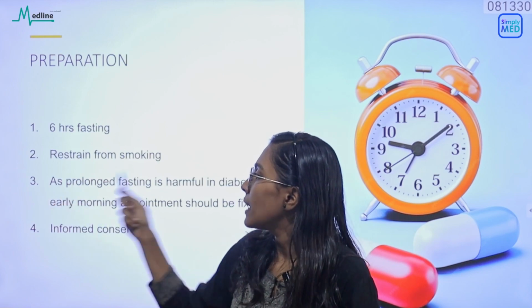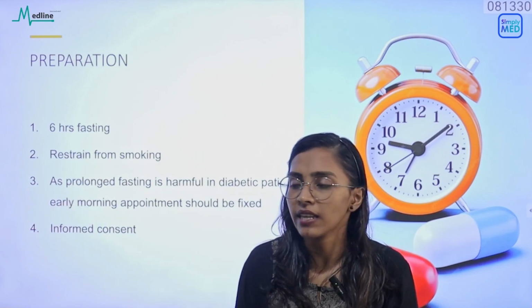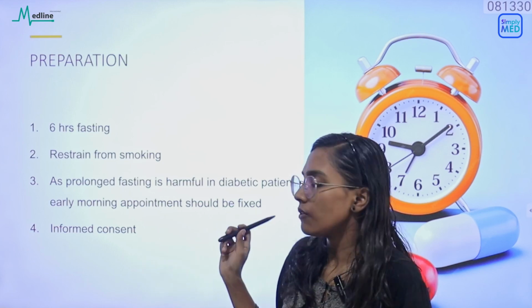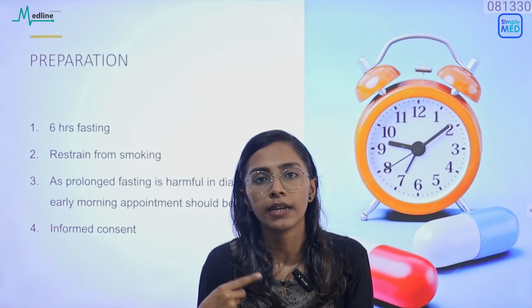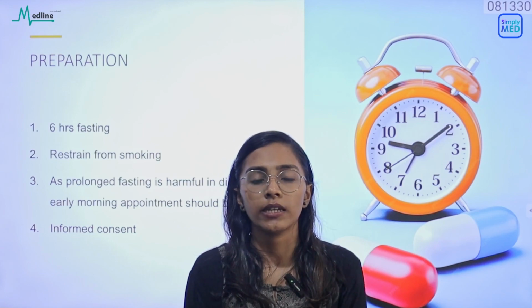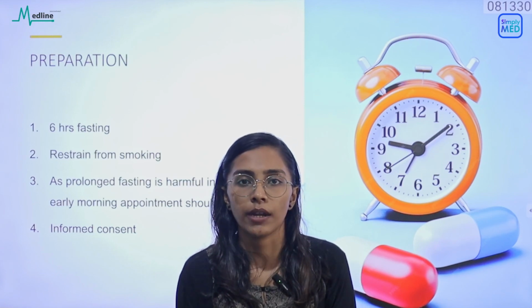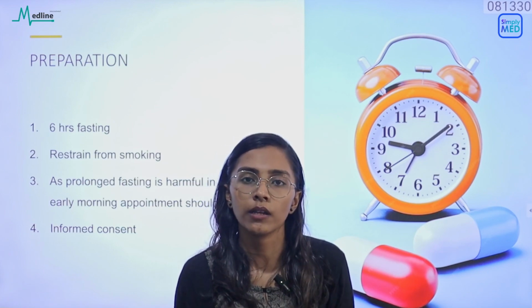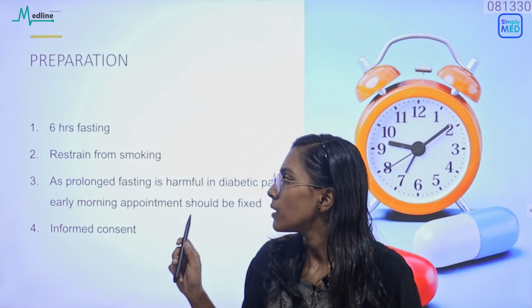But in the case of diabetic patients, as prolonged fasting is harmful for them, we can fix a morning appointment, or advise the patient to at least come on an empty stomach in the morning. Rather than fasting for 6 hours, just an empty stomach in the morning can do fine.